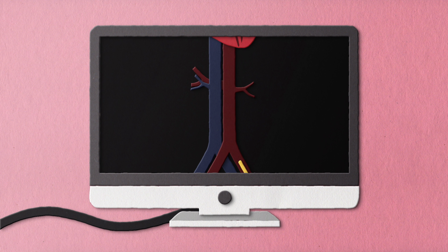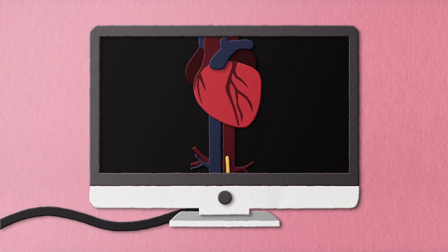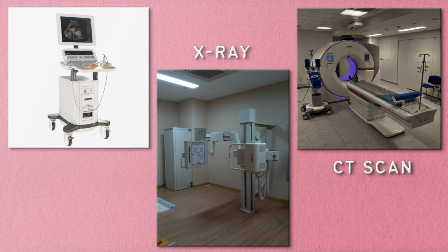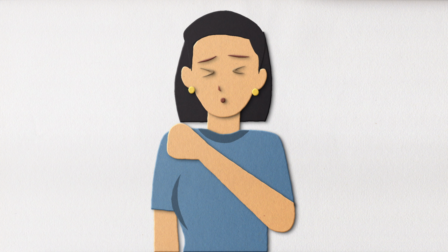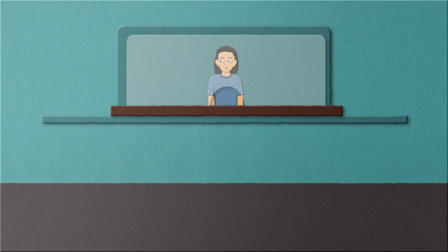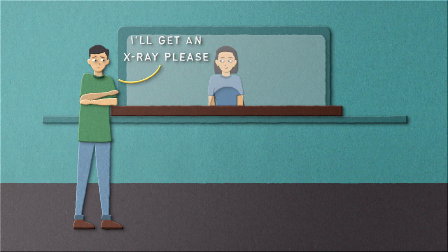Medical imaging techniques are used by healthcare professionals for many reasons. These techniques may be used to help doctors find their way when introducing catheters or needles in your body. If medical imaging did not exist, they might end up poking something they shouldn't. Medical imaging tests like CT scans, X-rays, and ultrasounds are done to screen for health conditions before symptoms appear, diagnose a potential cause for existing symptoms, or even monitor an ongoing condition. Medical imaging test results are crucial in helping healthcare professionals decide the best treatment options for each patient.